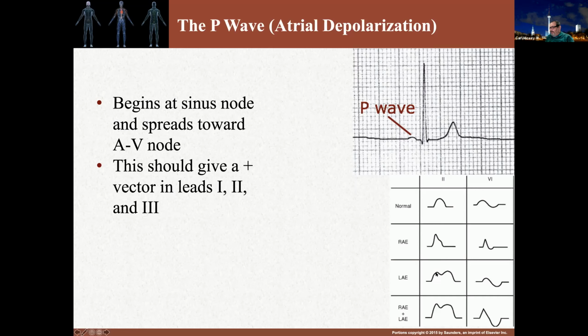In a left atrial enlargement, you have your standard looking P wave, except it doesn't continue to go down. Now, since I've got more atrium in the left atrium, I get the second blip here. And also my P wave is kind of elongated. And in V1, this is shown as an elongation of the downward deflecting P wave from the left atrium.